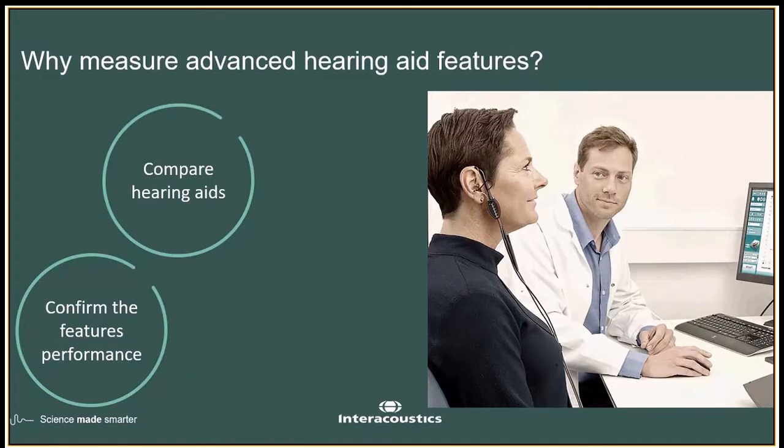So yes, even though multiple hearing aids have noise reduction features or frequency lowering features, their application, or the way that they do what they do, may not be the same in every manner. It can vary. They can have different methods or philosophies in the way that they want to carry that out. So it's a nice thing that we're able to show and compare different hearing aids, or it may even be that you're comparing different settings of these features within the same hearing aid. So maybe a softer or a louder application. And it's allowing us to see that, and that's what we really want to do here.